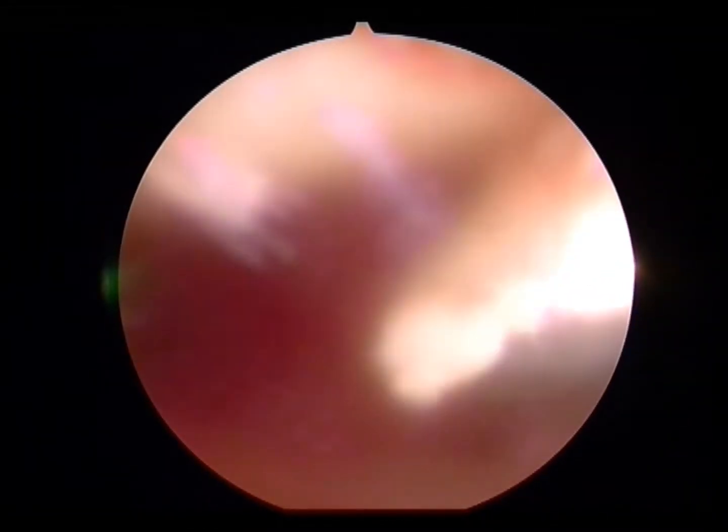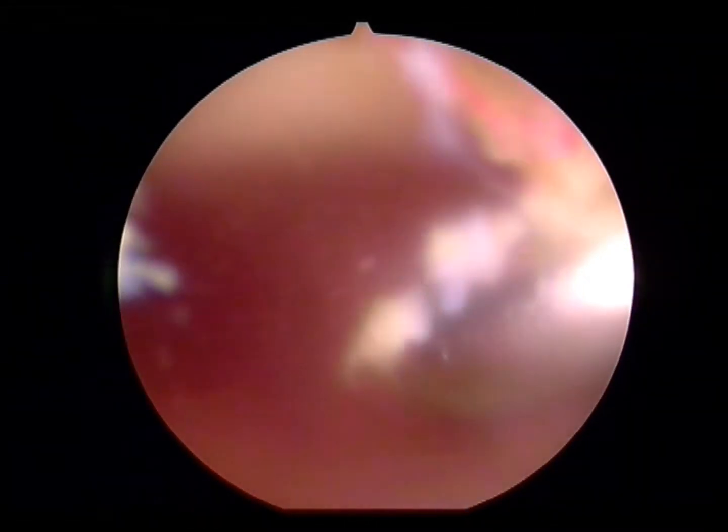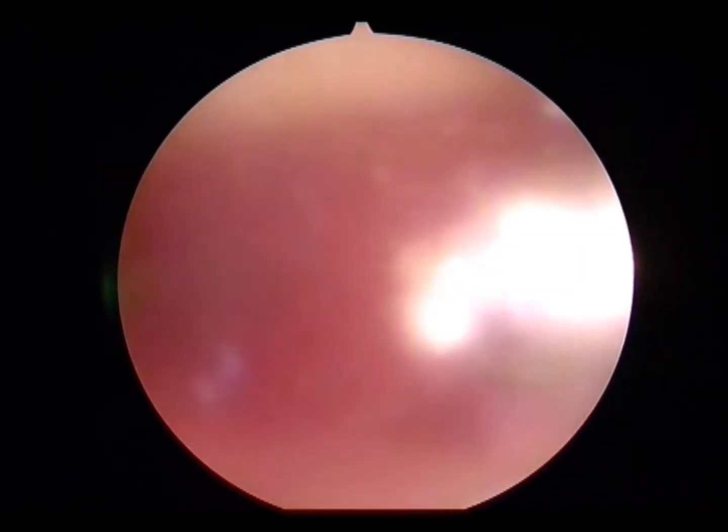Here you can see if you use a shaver on its own, you get bleeding into the knee joint. Blood causes adhesions, and adhesions cause the patient postoperative pain and knee stiffness.